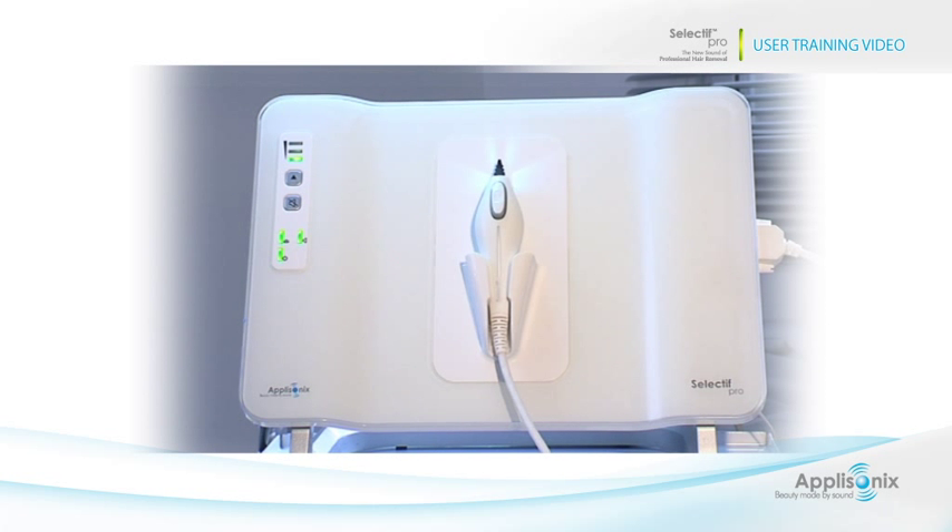The Selectif Pro system includes three components: the main unit, the probe, and the foot pedal.